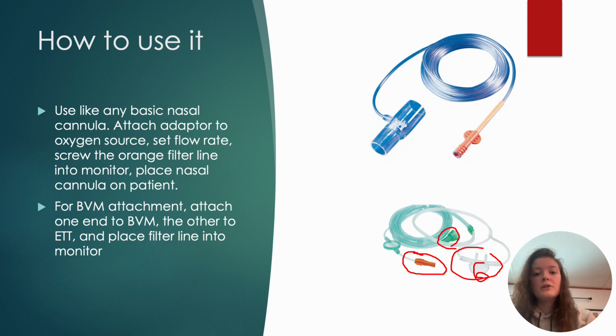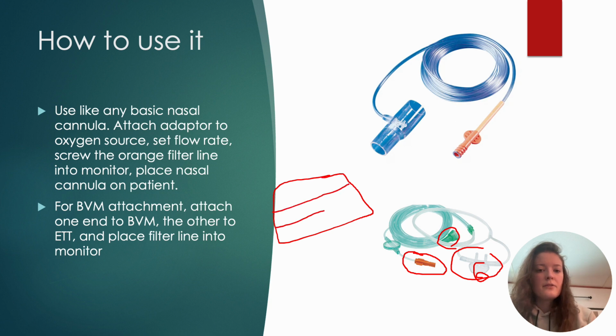Now when you have the monitor, I'm not an artist, but we will try to make a drawing here. So on your LifePak 15s, you got the screen and there's 3 lines. You got your little pulse rate up here, not a great pulse rate, your SpO2, which is normally in blue. And then normally it's like another kind of pulse rate on this third one.